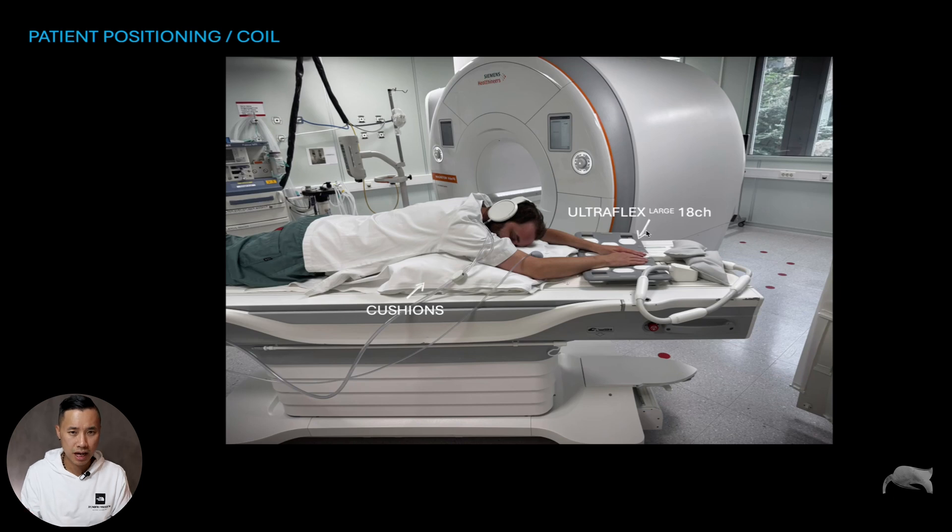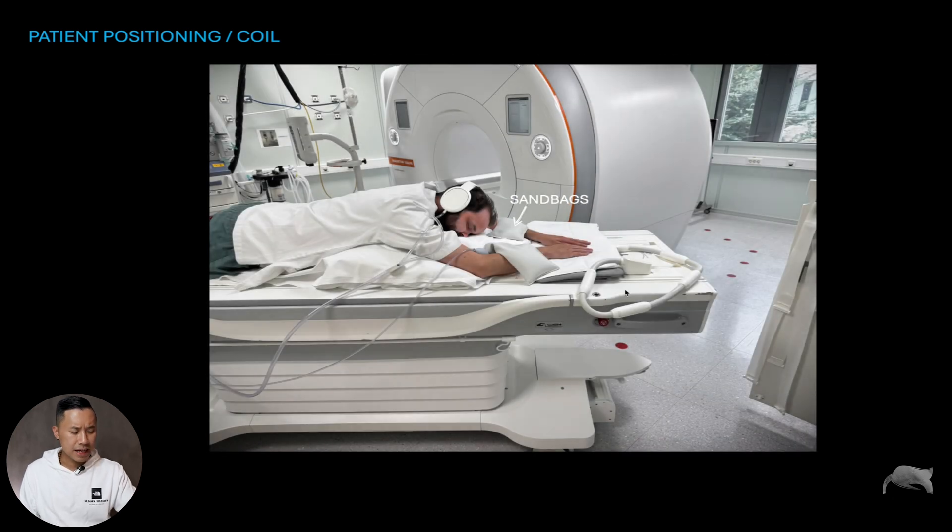We used an Ultraflex large 18-channel coil. You can also use the spine coil if available, but I preferred the Ultraflex because its smaller elements cover both hands better compared to the spine coil with bigger elements. The second consideration was whether the patient could tolerate this position — we were lucky they could. We also used sandbags on both hands to fixate them and keep the fingers together, preventing bad fat saturation and unnecessary coverage.